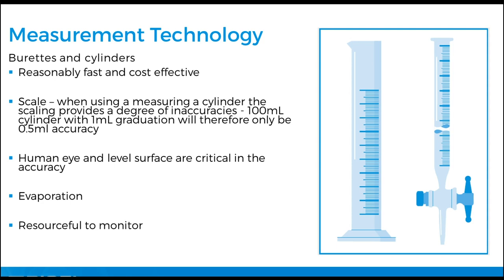Now, those alone cannot be trusted. I'm personally, coming from a metrology background, looking at burettes, looking at scaling, you've got evaporation and all the other environmental conditions to consider. Just for me, very resourceful to monitor, and not particularly that accurate. They can be accurate if you get the scaling correct, but they're just a resourceful, time-consuming device to use.